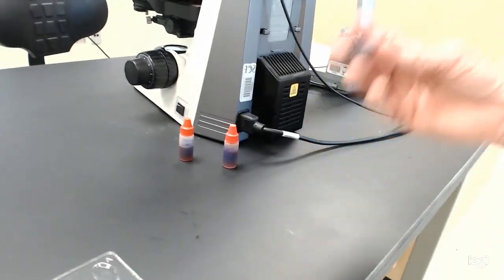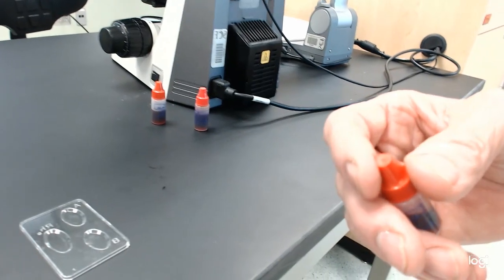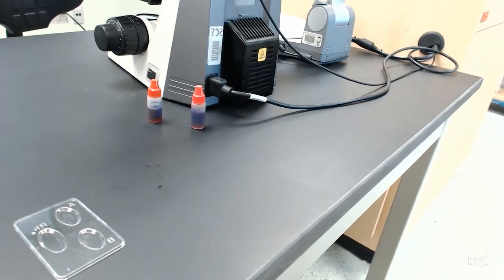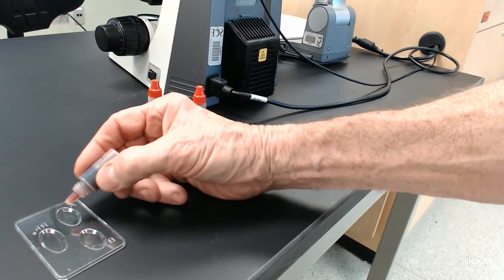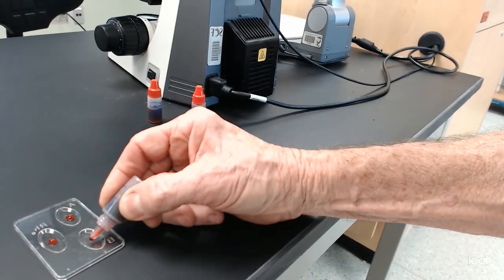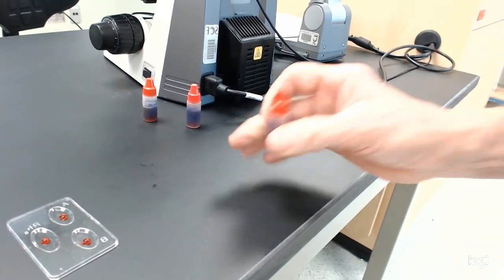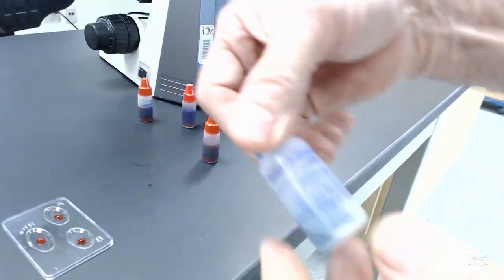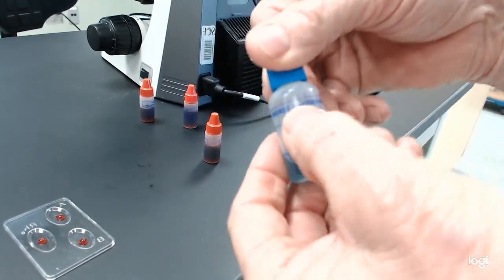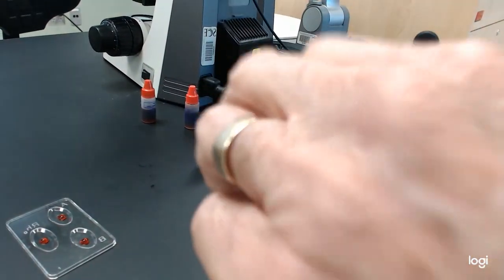And what I'm going to do is I'm going to test. This happens to be Mrs. Brown. Okay, we're going to put a sample of Mrs. Brown's blood in each of these three things. I got a drop in that one, I got a drop in that one, and a drop in that one. Okay, and so now I'm going to check and see with the right reagent whether this one is going to find A. This will find antigen A. So I'm going to put some of this in the A. Just a drop will do it.